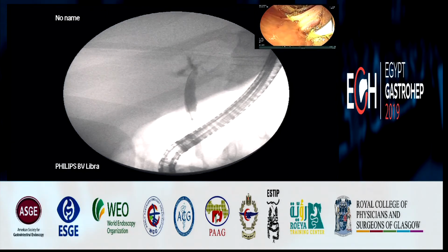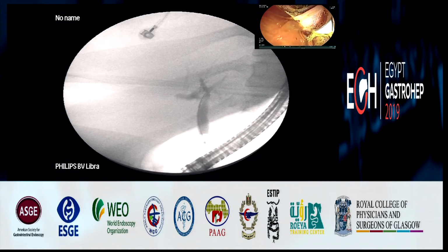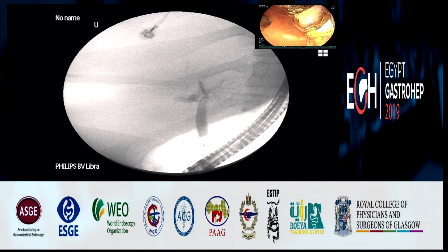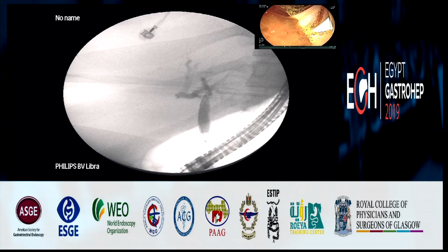So that's her confluence there. That's, yeah, that's better. So now I understand what you say, that the intrahepatic ducts seem a bit rarefied, huh? Yes. Okay, I'll go a bit down to see what's going down.